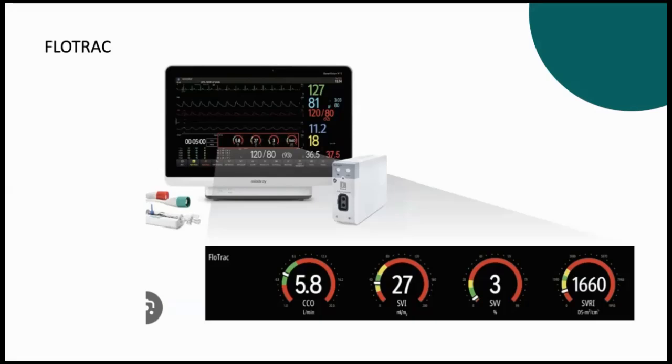So one of the most recent or the most advanced monitors in the country we have got. It has the Edwards Lifesciences module here, which is the FloTrac module, right? And we also have this at the same time. We'll talk about awareness on another day.